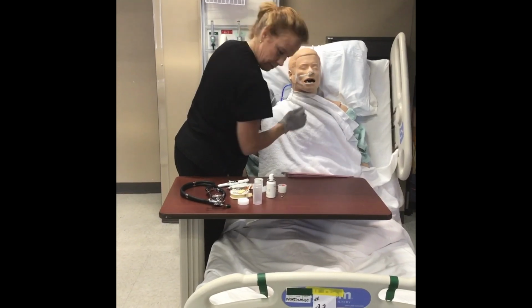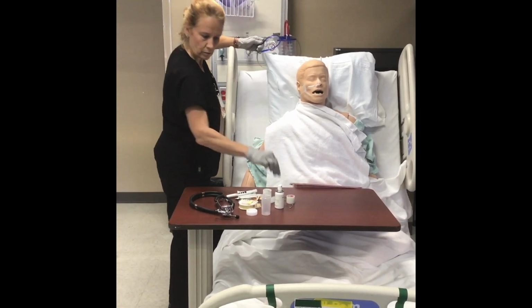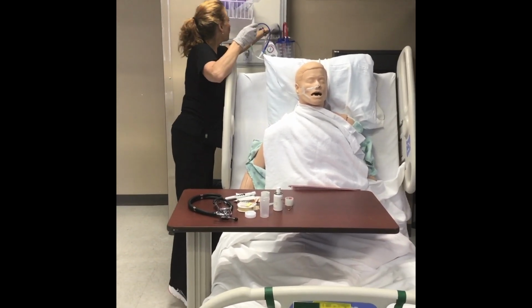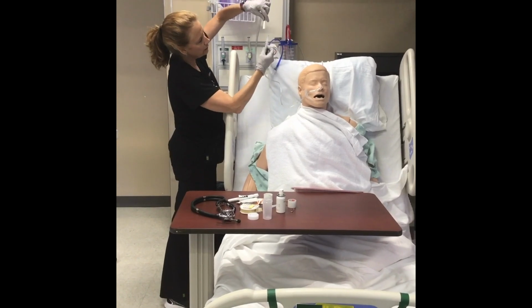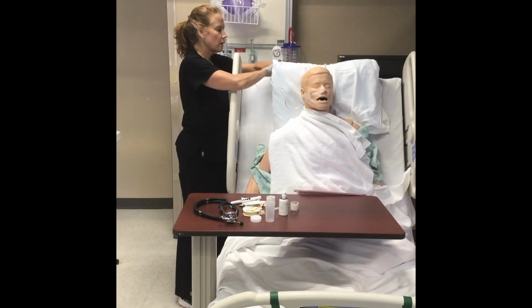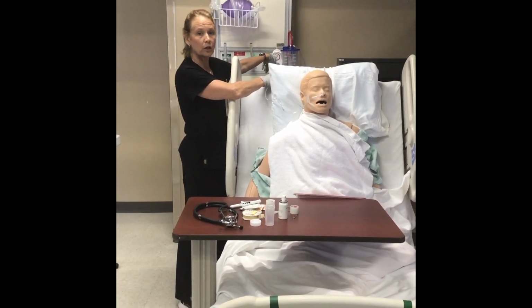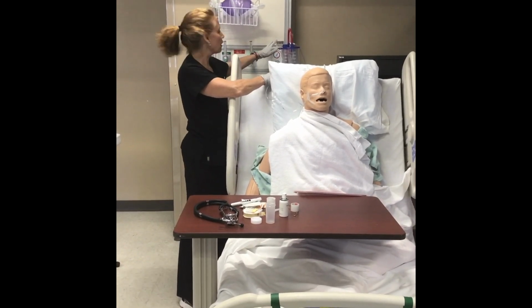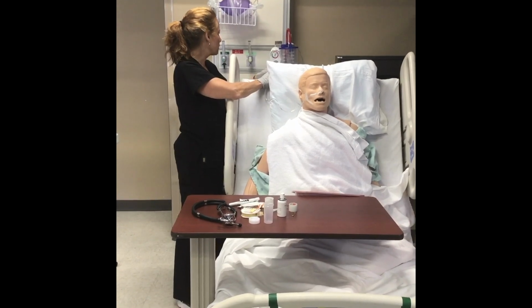Okay, how are you doing so far? I'm doing okay. Okay, next I'm gonna hook it up to suction. We're gonna grab the straight connector, and you're going to attach it clear to clear. And then to turn on the suction, you want to make sure that the suction is working before you turn it on. And you do want to make sure that you're in the green zone or low intermittent. If we have it on regular, it means that the suction is continuously processing. By having it on intermittent, it means the suction is stopping and starting so that we're not creating more complications for the patient.